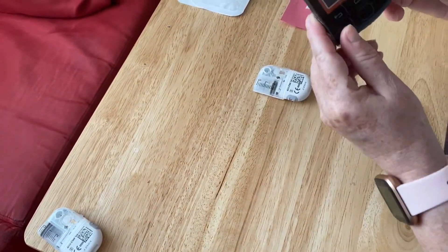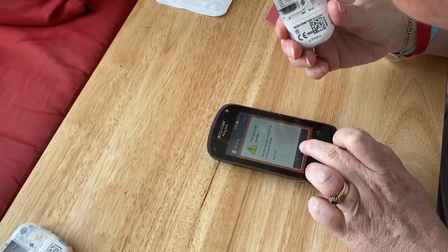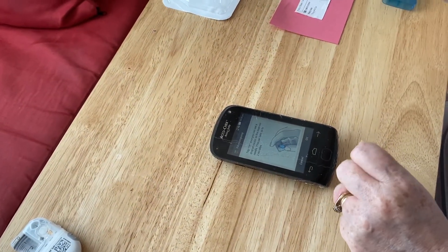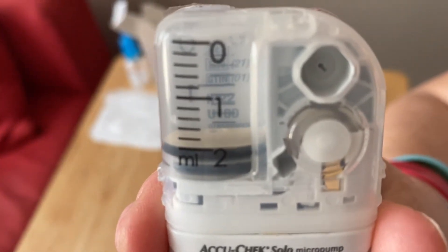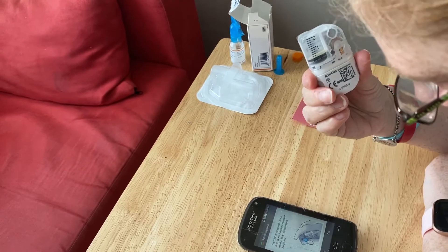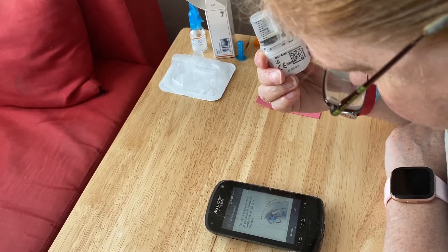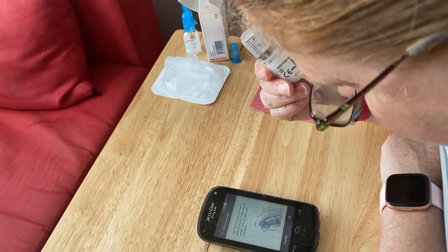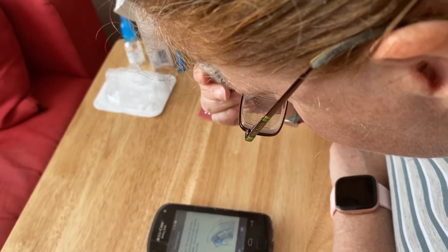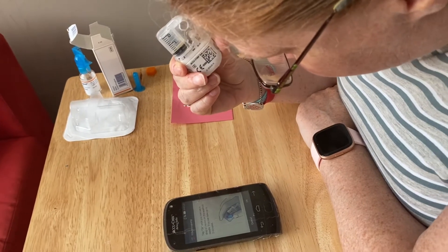Now it's saying 'fill reservoir needle,' so I press fill. You can hear the reservoir filling — I'm just looking for the insulin to come out of the needle. This can take a little bit of time; sometimes it's really quick and sometimes a little bit longer.